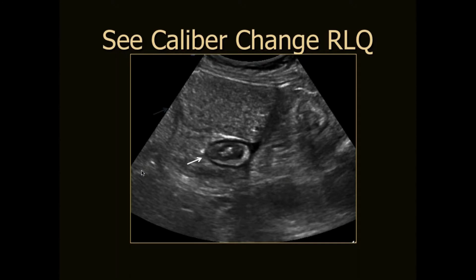So again, we would examine the entire abdomen, and as was nicely pointed out in the first presentation, we have to have a method whereby we can see virtually all of the bowel by doing a systematic evaluation of all of the quadrants and looking for, of course, what we see right here. We see dilated bowel, dilated bowel, dilated bowel, but in the center we can see a thickened portion, nice stratification, luminal apposition, and we can see that this loop of bowel is obviously different.